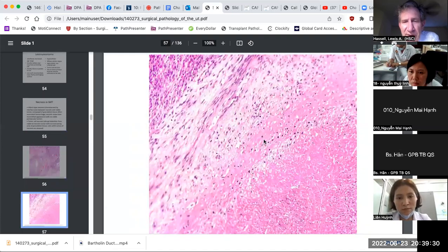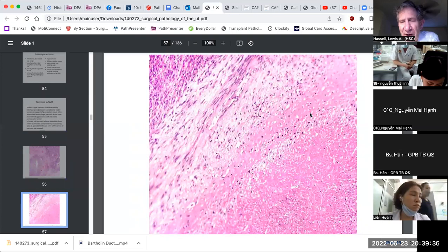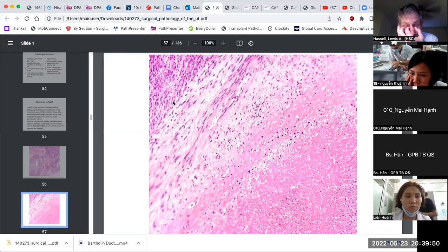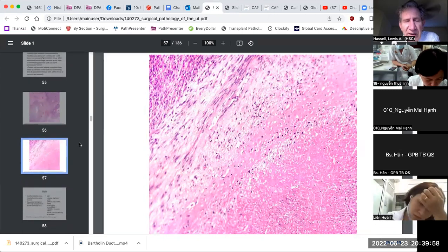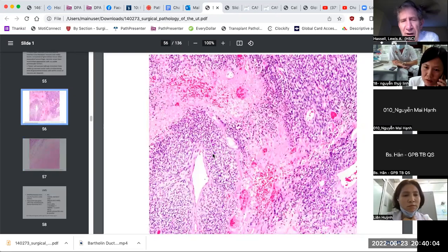In contrast, what's this? Well, this is infarct-like necrosis. We saw that earlier. A necrotic zone, very mummified or gangrenous type appearance, a pale zone, and then the tumor. Now, both types are possible to be seen in leiomyosarcoma. In general, I would say the tumoral cell necrosis, this kind of necrosis, would be more useful and more definite for likely malignancy.